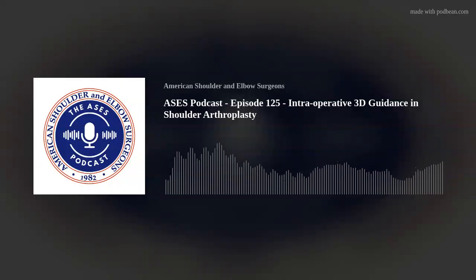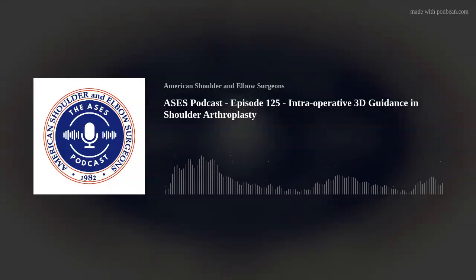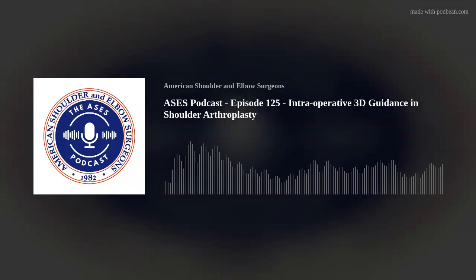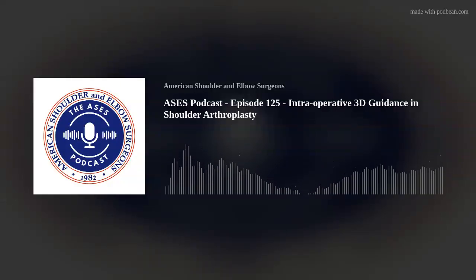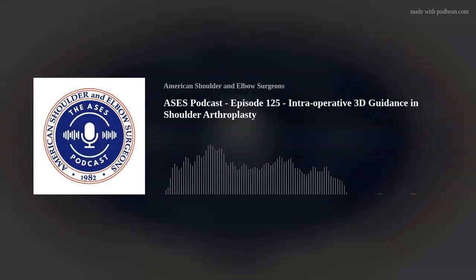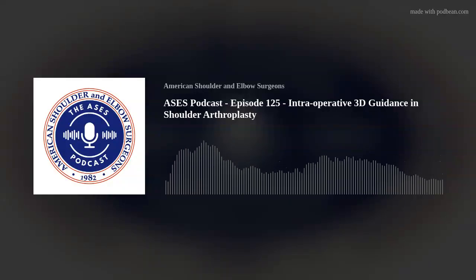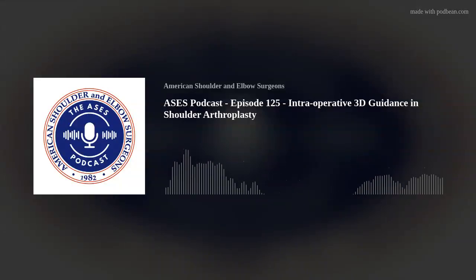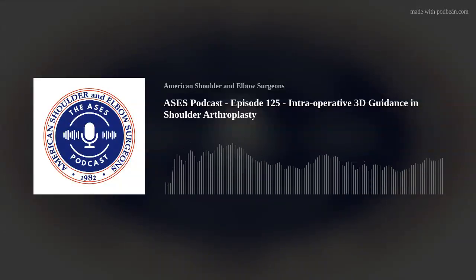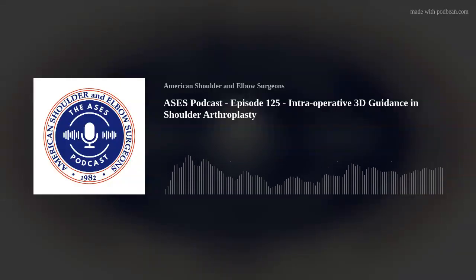Yeah, so I think that sets the stage. I agree with you all. I think this establishes almost universal consensus, at least among this group, that CT is definitely the gold standard for planning. As we continue to plan, let's look at an anatomic total shoulder replacement. Sumit, what are your targets for this? We can really build in what we want, either using allograft, using host bone, or with metal. I'm curious what you're looking to establish when you execute your anatomic total shoulder.